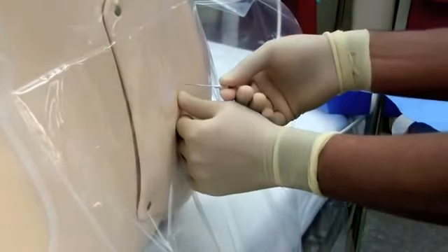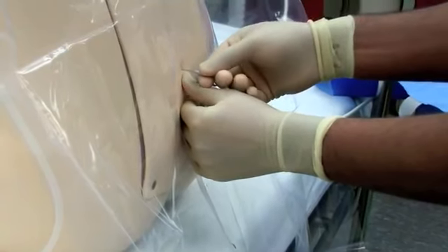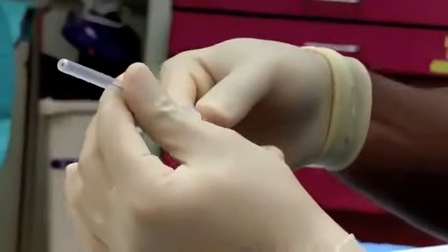Again, after identifying, the introducer needle goes in at a slight 15-degree cephalad angle, maintaining the midline. The bevel of the needle is important if you are not using a pencil point spinal needle, but we are using a pencil point spinal needle.